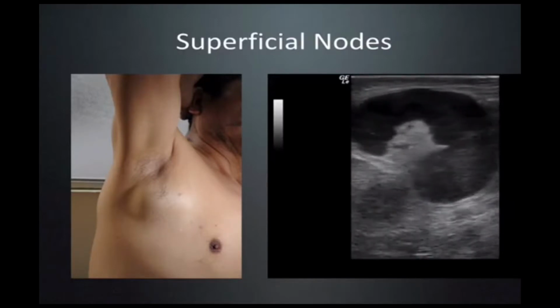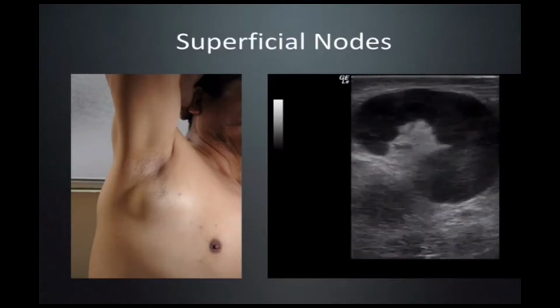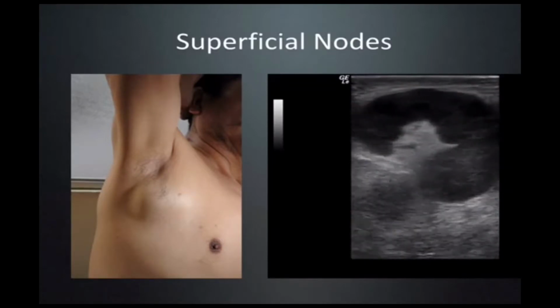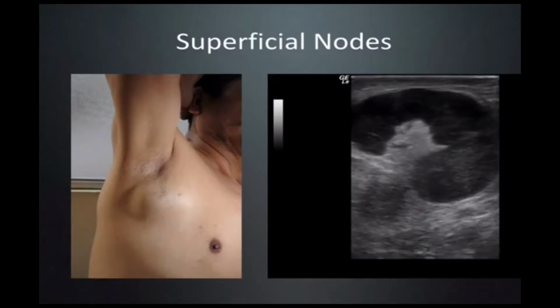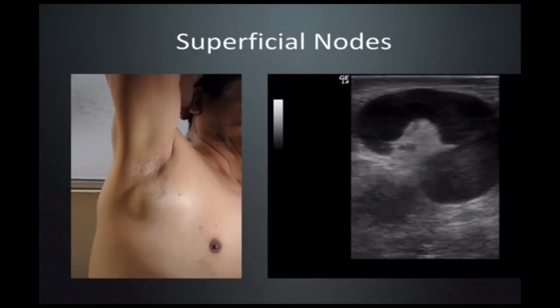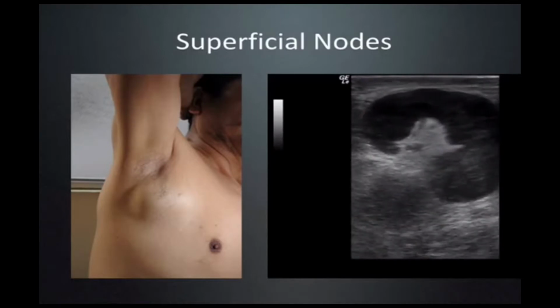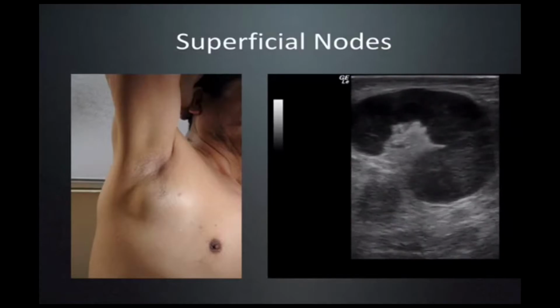If you look superior on the lymph node, you'll see that there's some hypoechoic areas which either represent cystic changes or indeed necrosis or early abscess formation. Unfortunately, there's nothing about this lymph node that tells me whether it's tuberculous or not, but it certainly is an abnormal lymph node. I think for any of us scanning this patient, it's incumbent upon us to either repeat the scan in a day or 2 or 3 to make sure that these are not small micro-abscesses, which will develop into a larger abscess. And of course, we don't have a tissue diagnosis, so that needs to also be addressed.